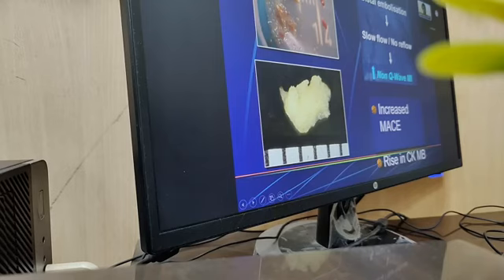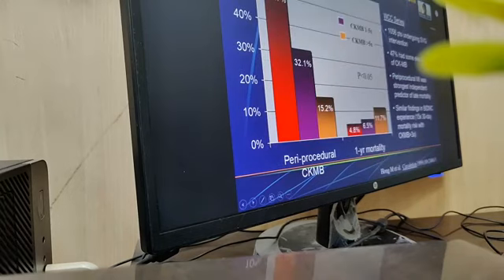So distal embolization is really a big enemy for interventional cardiologists. It can be in acute MI condition, or it can be saphenous vein graft intervention. In acute MI, we normally aspirate and do thrombosuction, but in saphenous vein graft, we have to use protection devices. I will tell you how to use it. So despite stenting, the data shows CKMB rise predicts mortality.